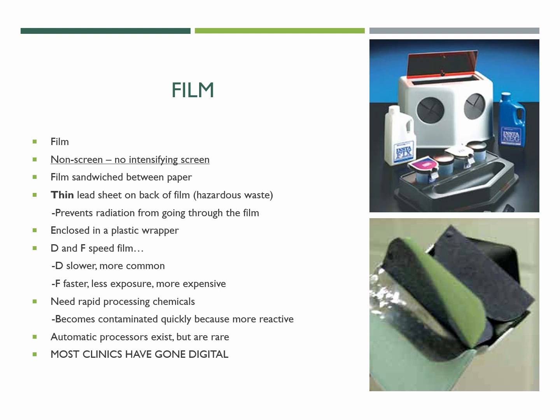There's D and F speed film, so D is slower, it's more common, and F is faster. Less exposures, but more expensive. So you can appreciate most clinics would get D film.